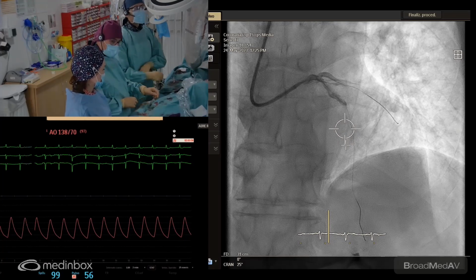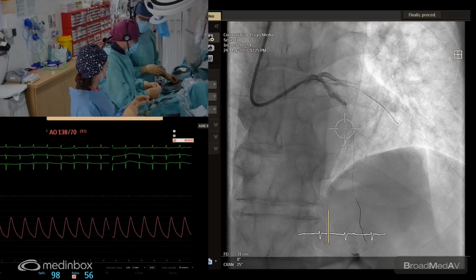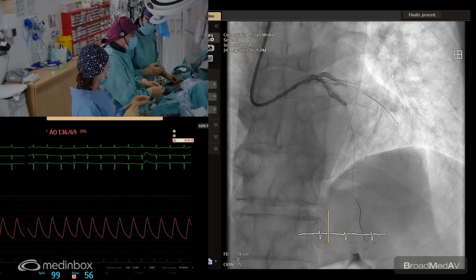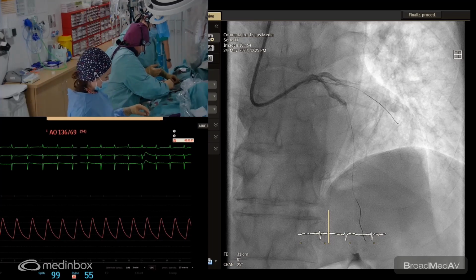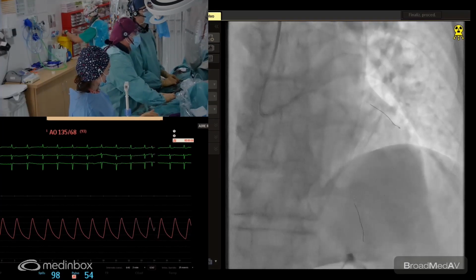Isabel is asking me about the heparin. As we are going through the radial approach, after the 31st minutes, we administer a little bit more heparin, and if we continue after 1 hour, we check with the ACT. This is a custom we have for the CTO procedures, and it's a very good thing, I think.